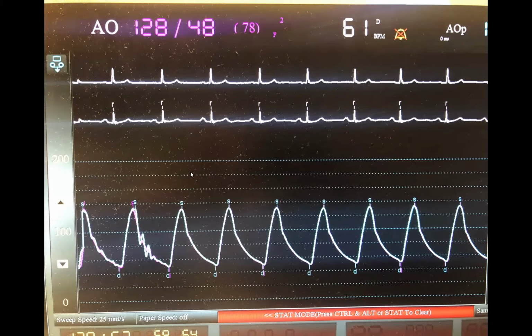Use what I described, the sheath and LV catheter. Or the ultimate technique is to use double access. So you have radial access with the LV catheter and femoral access with the aortic catheter. So you get 2 separate accesses, each for 1 cavity. This is the ultimate best measurement if you keep encountering issues with damping.